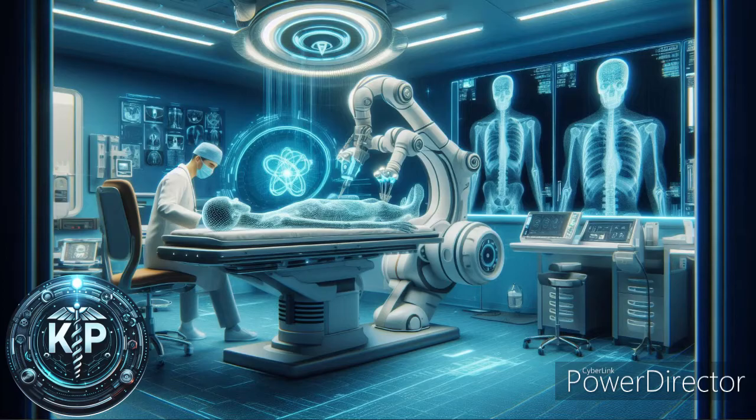Transfer learning. This involves taking a pre-trained AI model developed for one task and repurposing it for a new, related task. It's often used to adapt models to specific radiology applications with limited datasets. These algorithms are integral to the development of AI tools that assist radiologists in diagnosing and treating diseases more effectively. The way CNNs work in radiology.